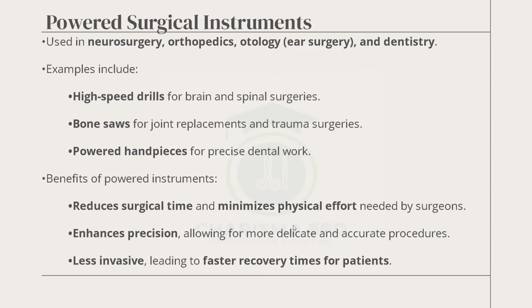Next slide. Good. Powered surgical instruments. They are used in neurosurgery, orthopedics, otology, that is ear, and then dentistry. So the dentist, you hear them drilling your teeth. If you pass by the OR and you hear those strange sounds, it means they are using the powered stuff.